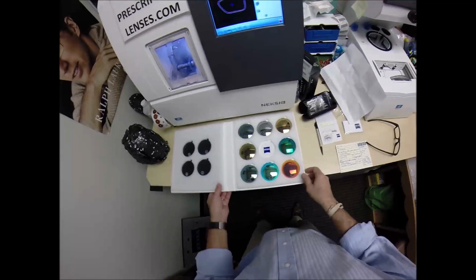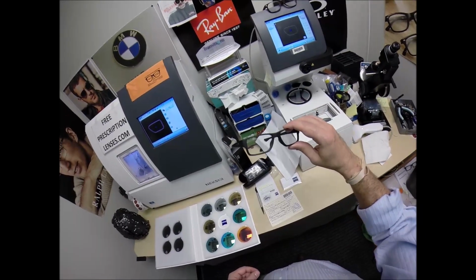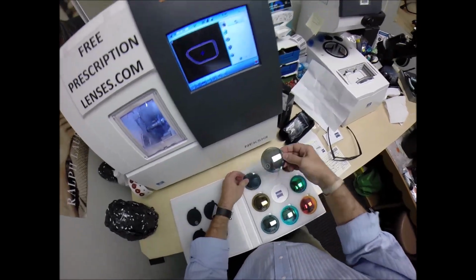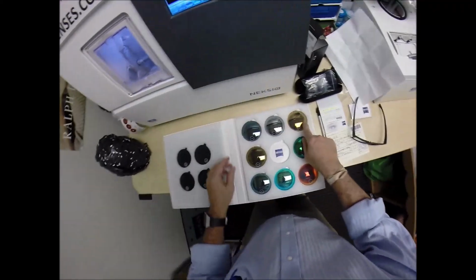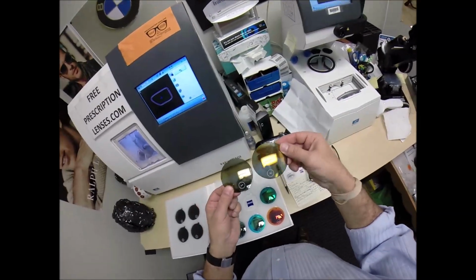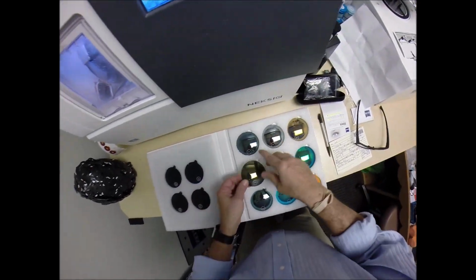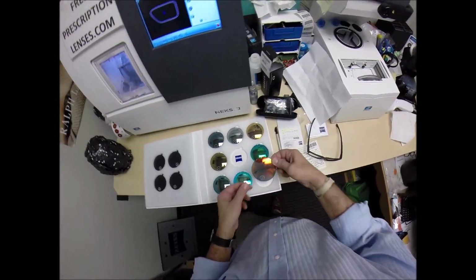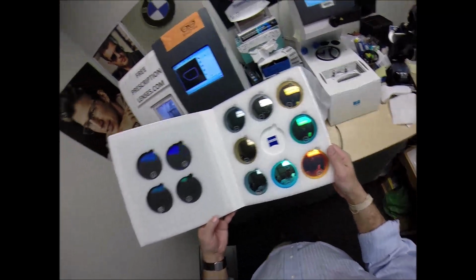So Zeiss also does mirror coatings. Jim or anyone else years from now, if you have another frame you want, or if you want to ever put mirrored lenses in here, they have what's known as white. It's just a less reflective. This is a very reflective silver. They call this white. The high luster silver, gold, bronze. So if this is white in reflection to silver, they call this bronze in reflection to gold. In comparison, a muted version of gold, a muted version of silver. We've got a green, a lighter blue, a brighter blue, and of course the red, which is almost a red, orange, yellow, depending on how that moves around. But I'll have these on the website soon.